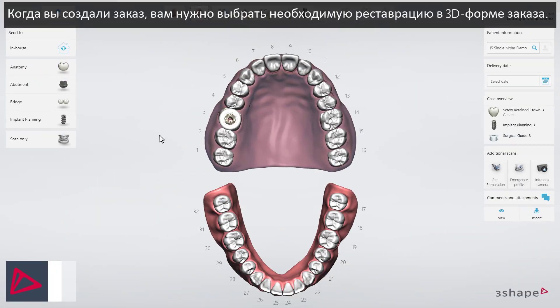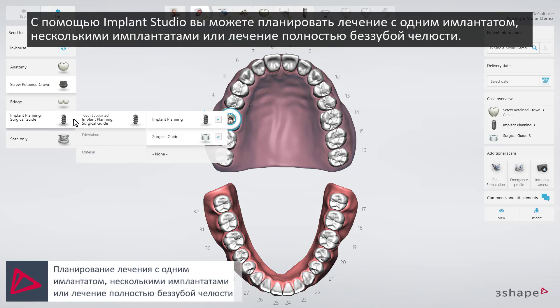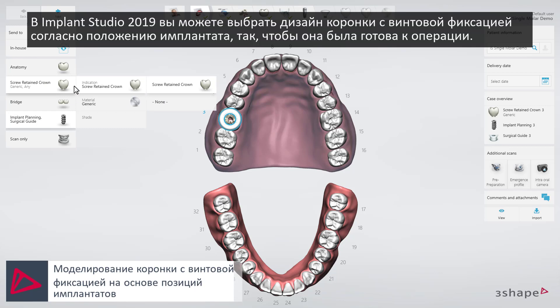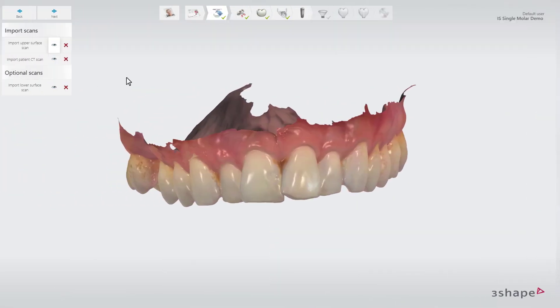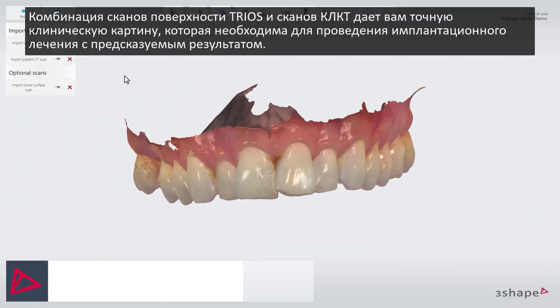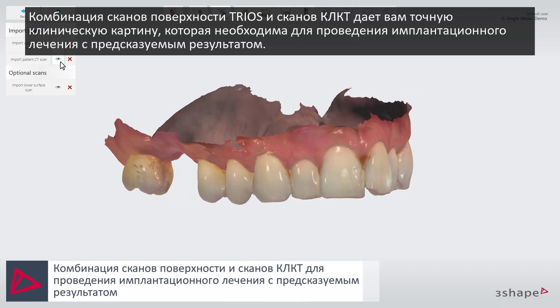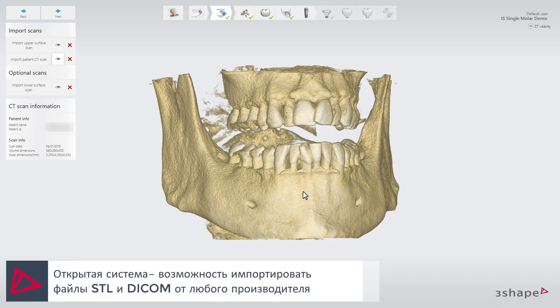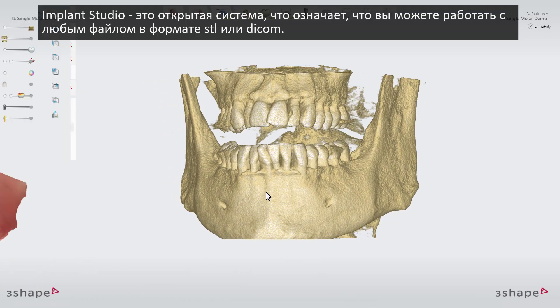When you have created your case, you start by defining the relevant indications in the 3D order form. You can plan single, multiple, or fully edentulous treatments in Implant Studio. In Implant Studio 2019, you can now choose to design a screw-retained crown based on the implant position and have it ready at the time of surgery. The combination of surface scans from Trios and CBCT scans gives you a very precise clinical insight that is essential when you want to carry out predictable implant treatments. Implant Studio is an open system, which means you can work with any STL or DICOM file inside the system.